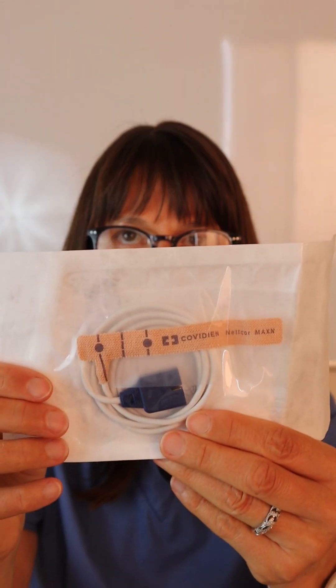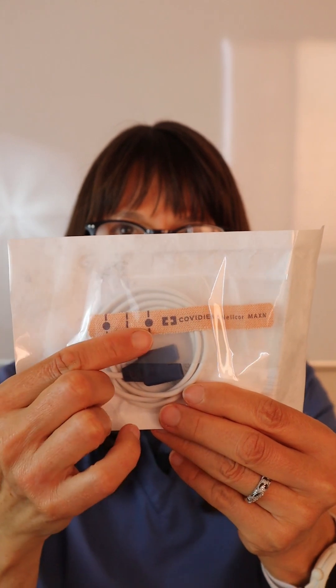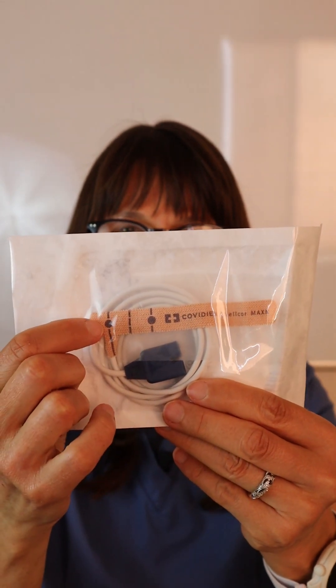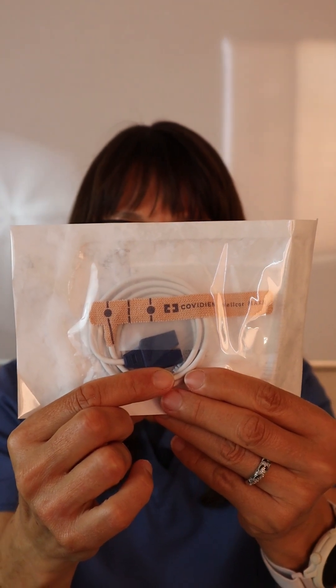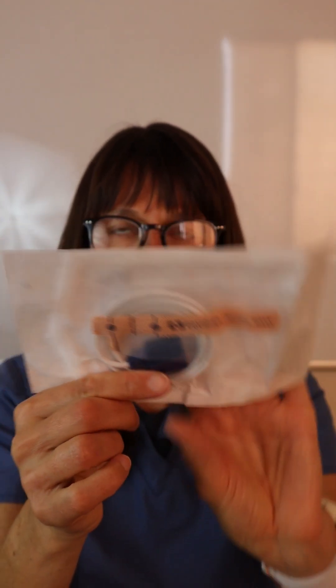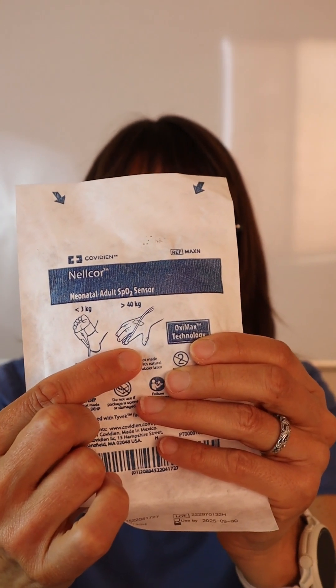We also have these types of pulse oxygenation detectors where it's a sticker, and between these two dots is where the LED light shines through. This gets plugged into the actual machine that detects it. On the back side it shows you how to do it, so you can just wrap it around the patient's finger.